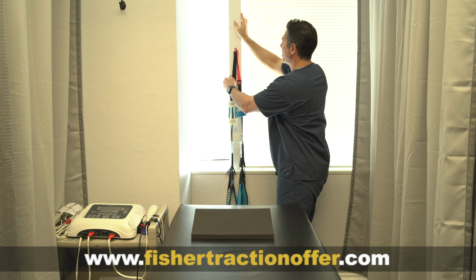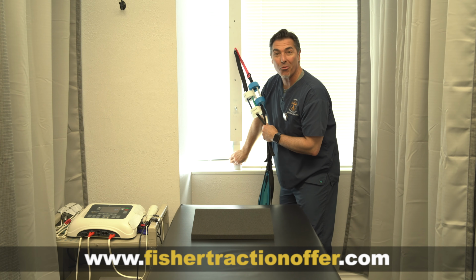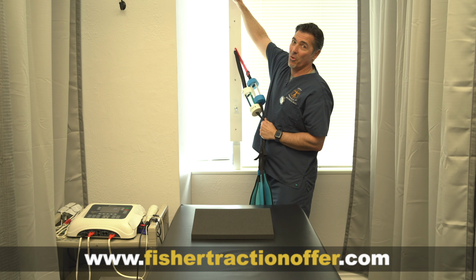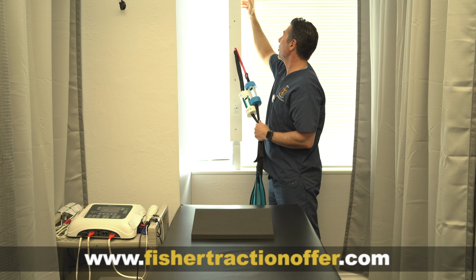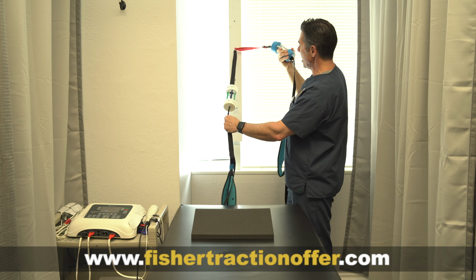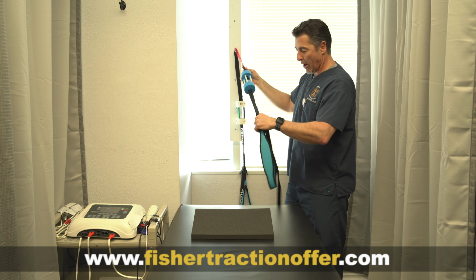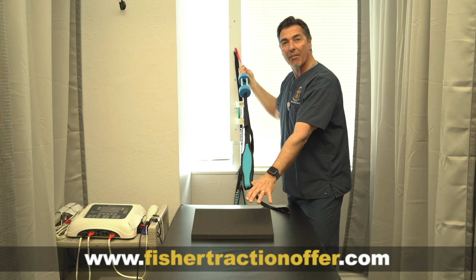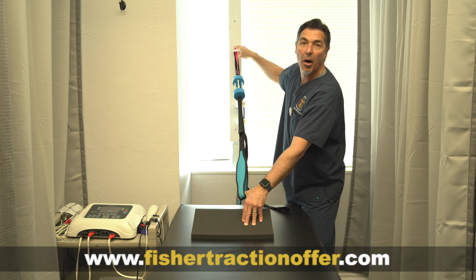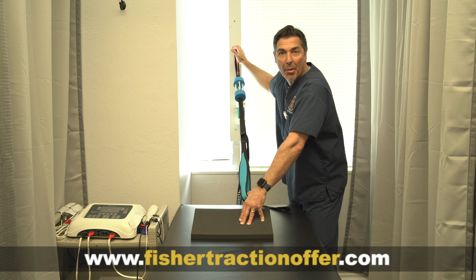I actually attached this directly to the window frame. I drilled it in, and again, this thing is solid as a rock. That metal or aluminum, I was able to drill right into it. Again, I have the eyelets, and we can vary the height. These two are at about a 35-degree angle, which is about 36 inches above the table, about the average height of a doorknob at home.